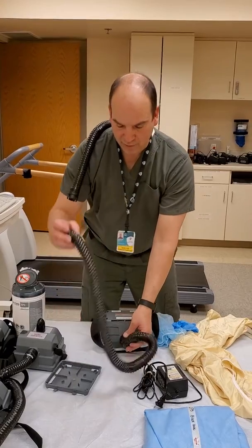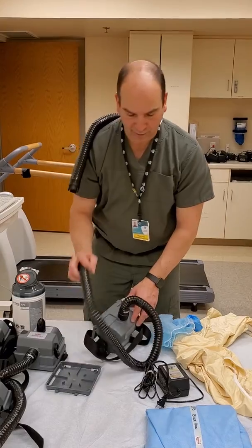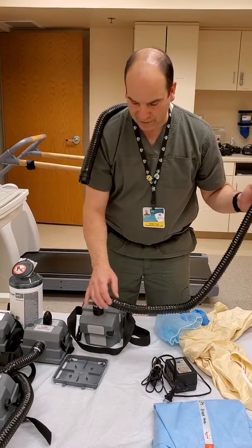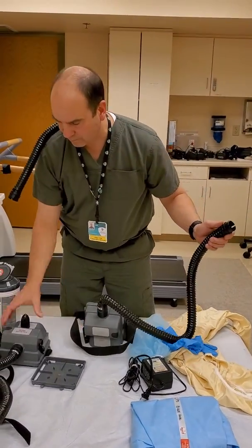We have the breathing tube that attaches. And with every use, you need to do a pre-use safety check. The safety check is done with the inspection of the hose assembly.